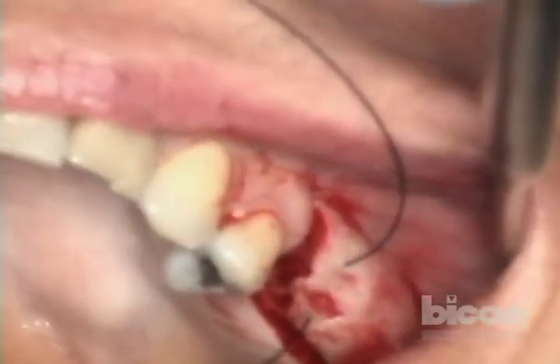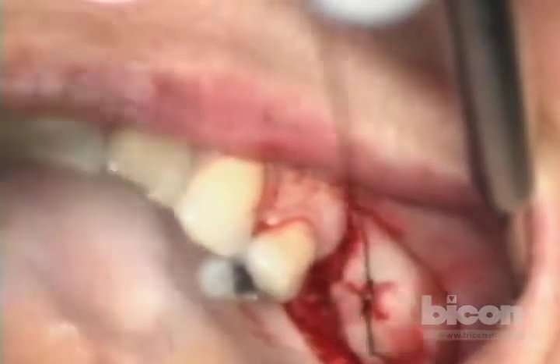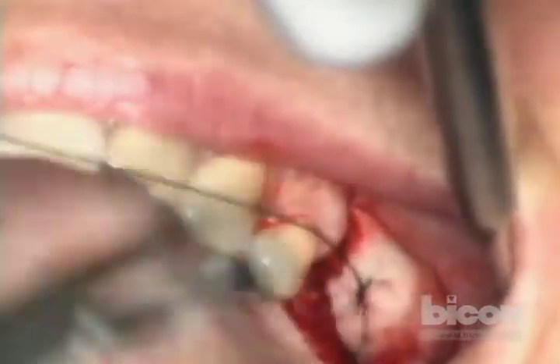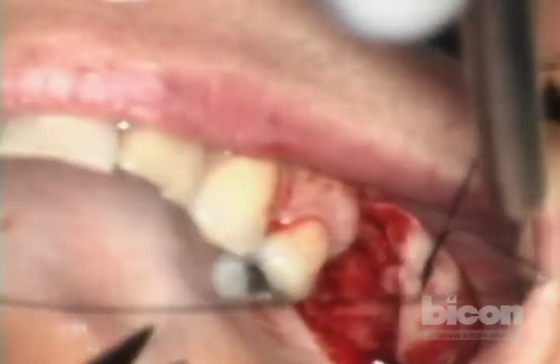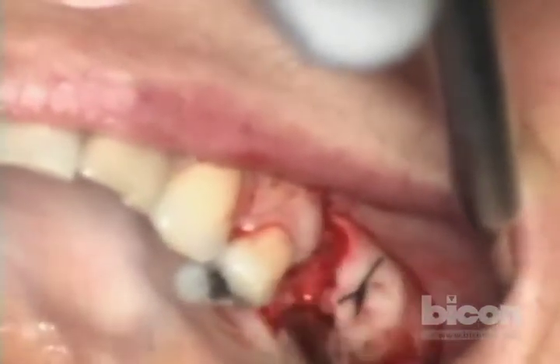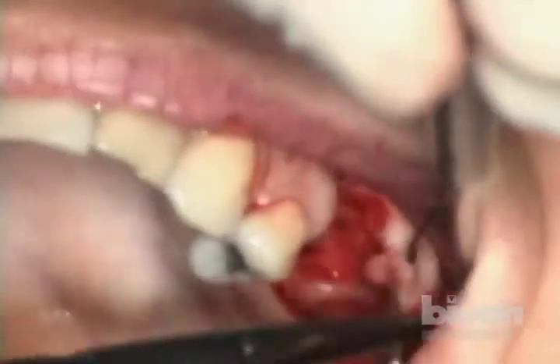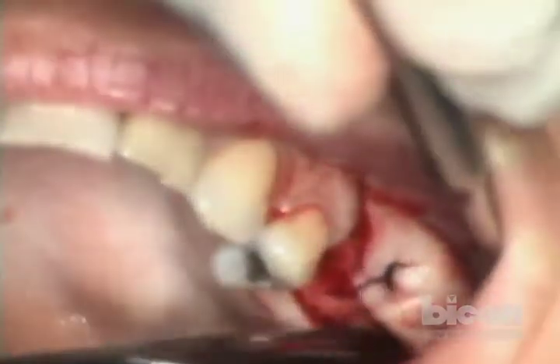This is only so that the tear doesn't get propagated while we're working — just to protect it. This is the boring stuff, but it's necessary for the smooth functioning of the technique.